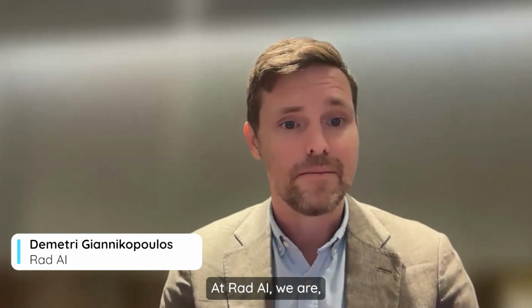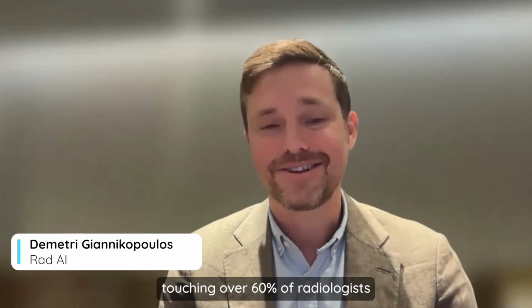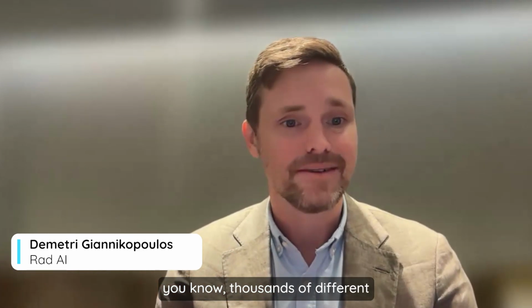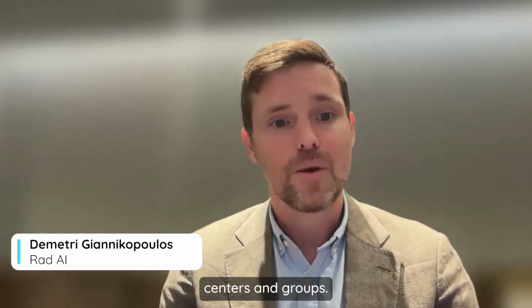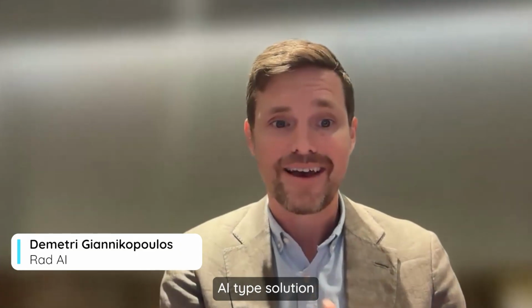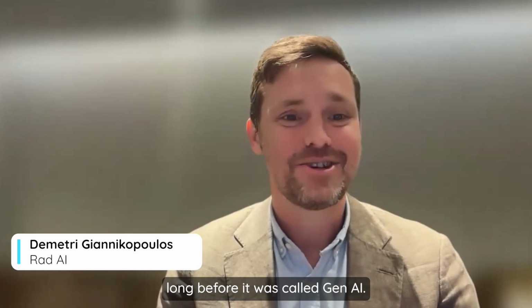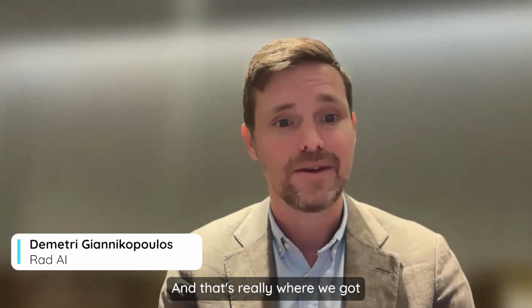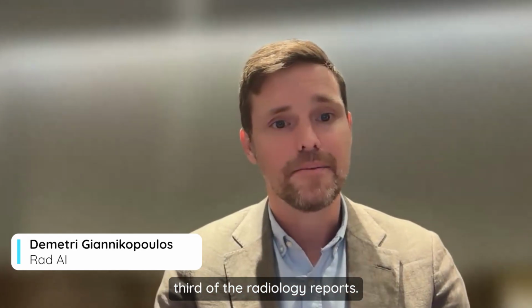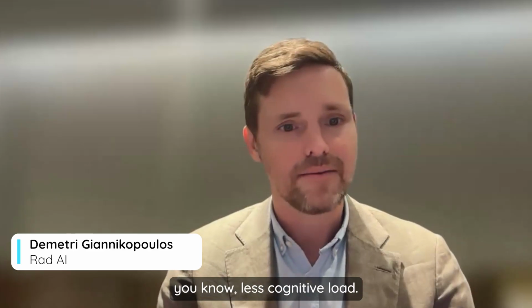At Rad AI, we are the leading artificial intelligence solution inside radiology, touching over 60% of radiologists in the United States, across thousands of different centers and groups. We have a very significant background in AI, being the first generative AI type solution released way back in 2019, long before it was called Gen AI. That's our impression solution, and it's really where we got started, which is automating that bottom third of the radiology report, so that the radiologists are able to work through the day a bit faster with less cognitive load.